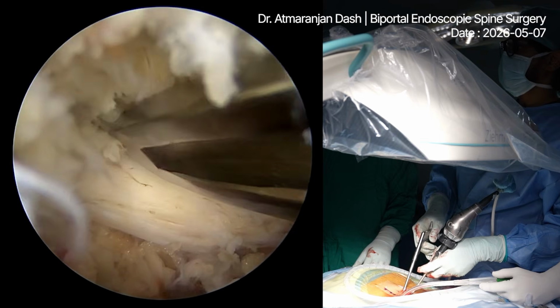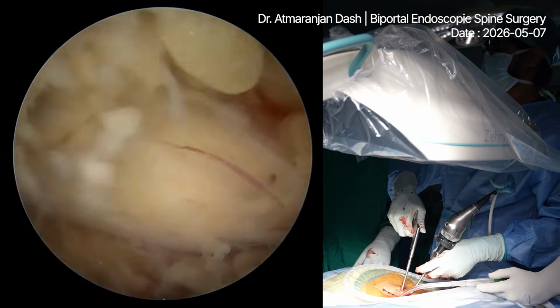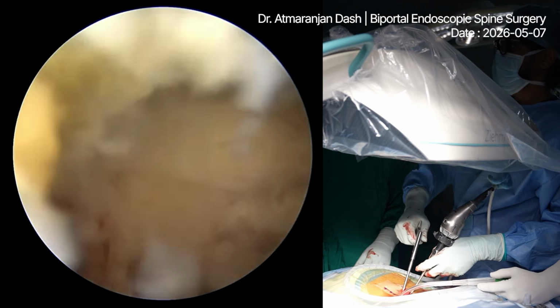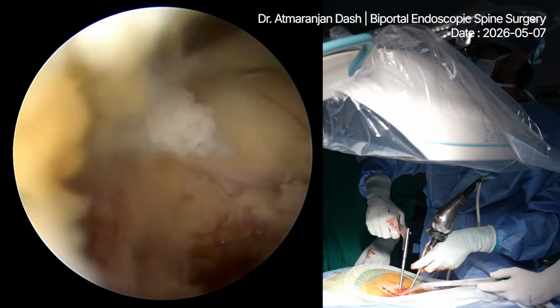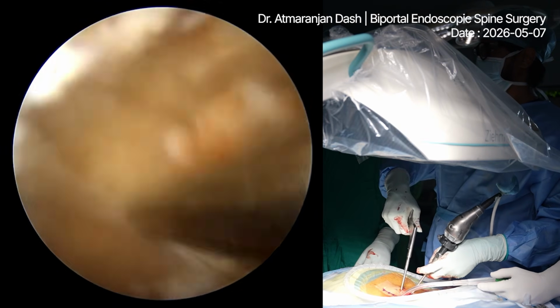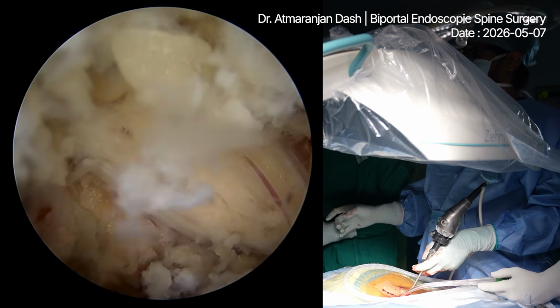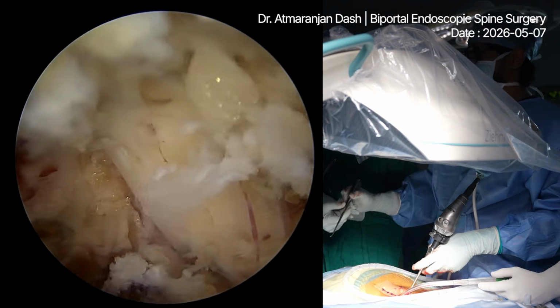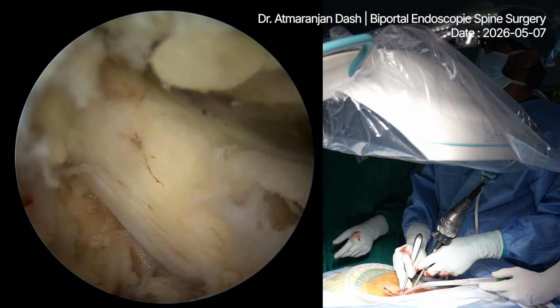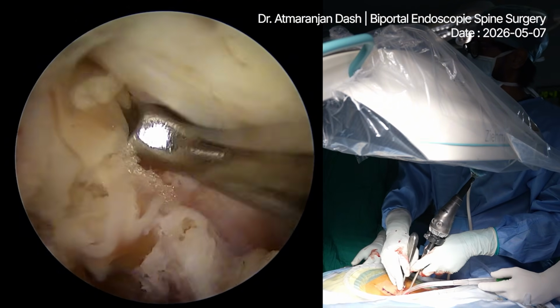Short, you see this is the foramen. I believe the foraminotomy was done before. Root is, yes. You see, this is how the previous foraminotomy looked like.